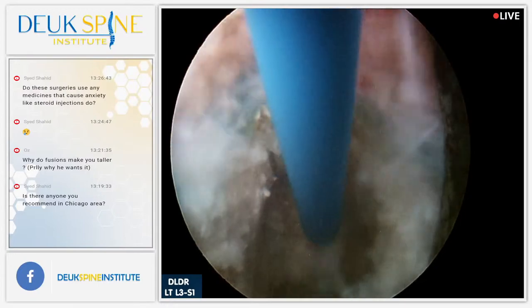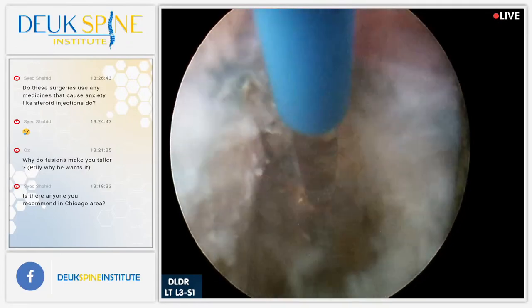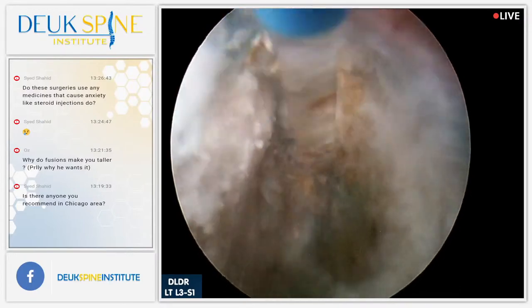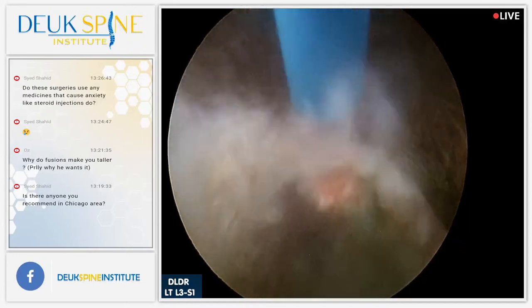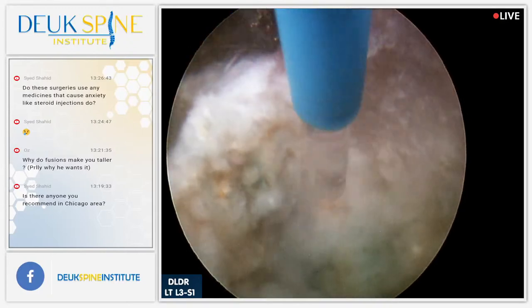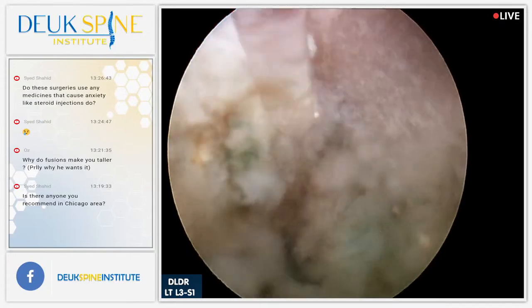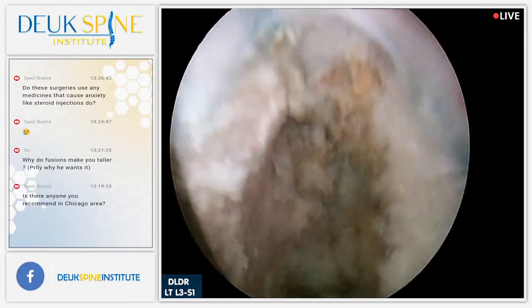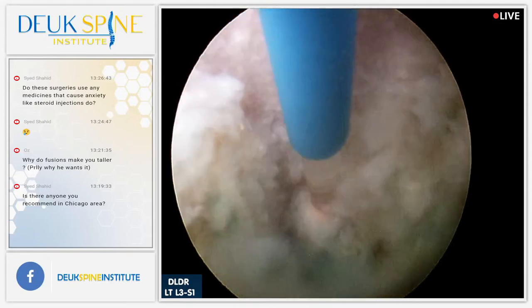So have you ever seen anybody walking hunched over because their back hurts? If you get rid of their back pain and put a spacer in there, you can actually have them stand straighter, and then they're going to be taller just because they're standing straighter. But they're not really taller. So the effect of tallness with spine fusions, with cages, is not really something that you should ever aspire for. That's not why we do the surgery. At least it shouldn't be, though I wouldn't be surprised if some surgeons market it that way. So it's the placement of the cages where the collapsed discs are that gives you additional height, quote unquote height.